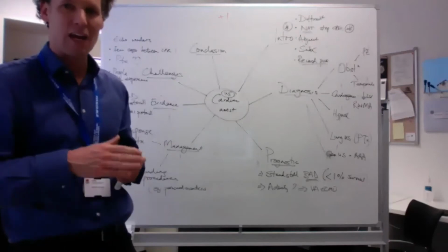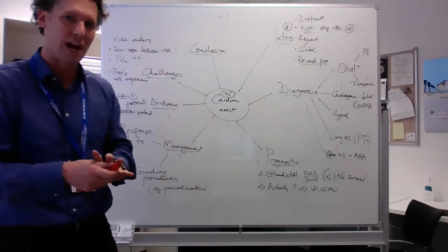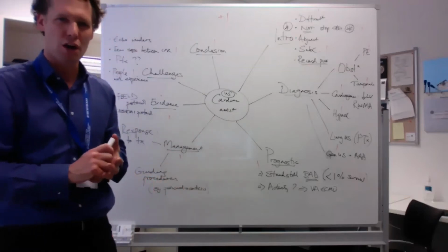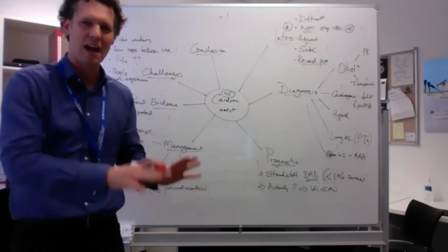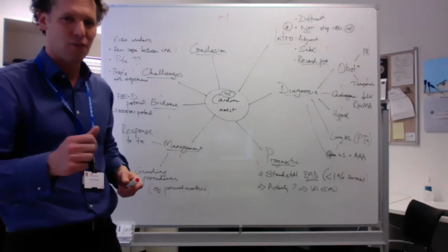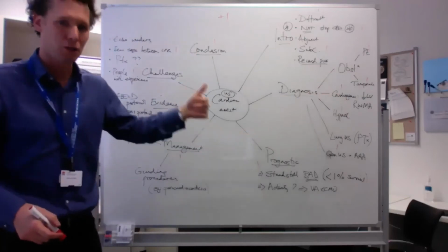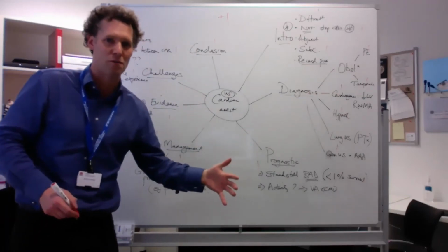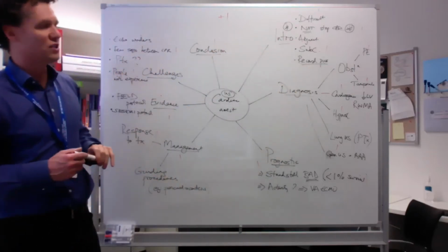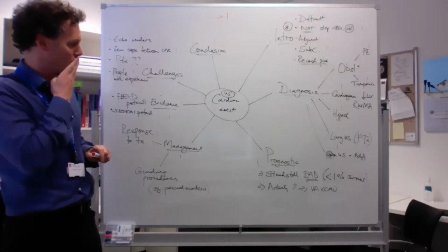You know, say it would be very clear if it was peri-arrest or arrest, echo versus general ultrasound. Discuss your use in the management of. It'd be those kind of questions, I think, is generally where the exam has been trying to lead. And in that regard, it's not just saying, what's the differential diagnosis of cardiac arrest with echo? That's that question. But using ultrasound in someone who's having a non-traumatic cardiac arrest, that's the whole question, right? Under the terms of think broad and answer the question. Yeah? Yep.